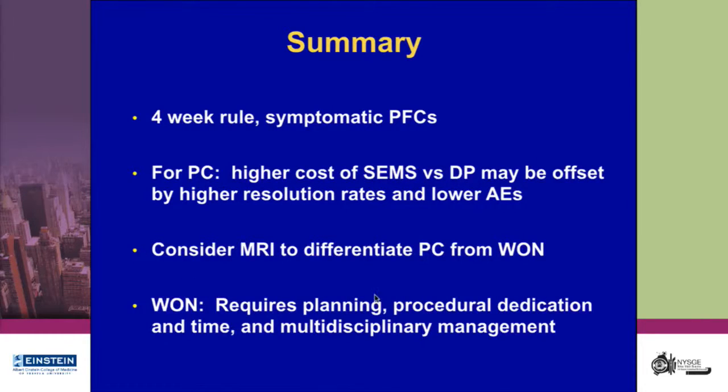Consider an MRI to differentiate a pseudocyst from a WON, and when dealing with the WON, there's an editorial from Dick Kozarek with the title, "Not for the Uncommitted." You have to be committed. It requires planning, procedural dedication, and a lot of time, and multidisciplinary management.